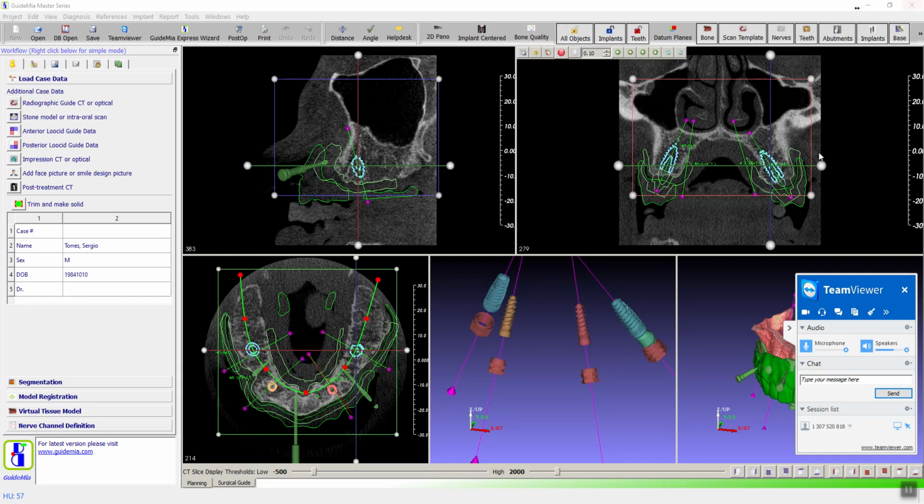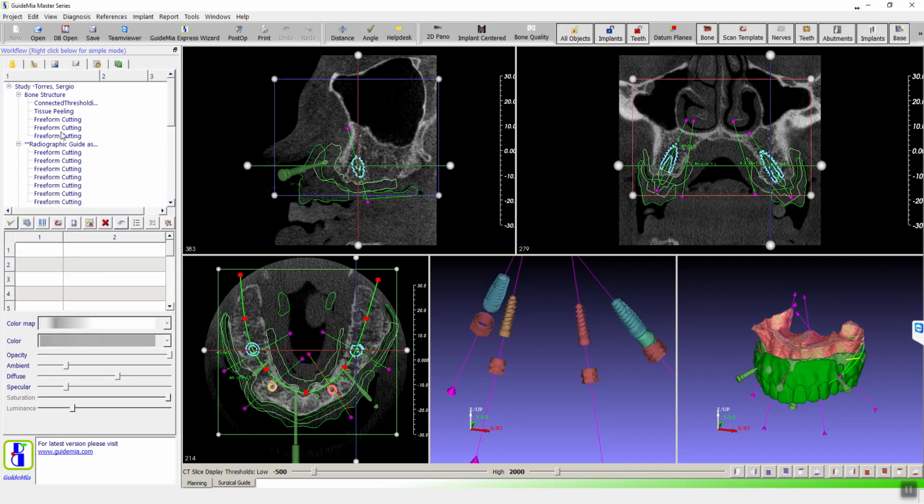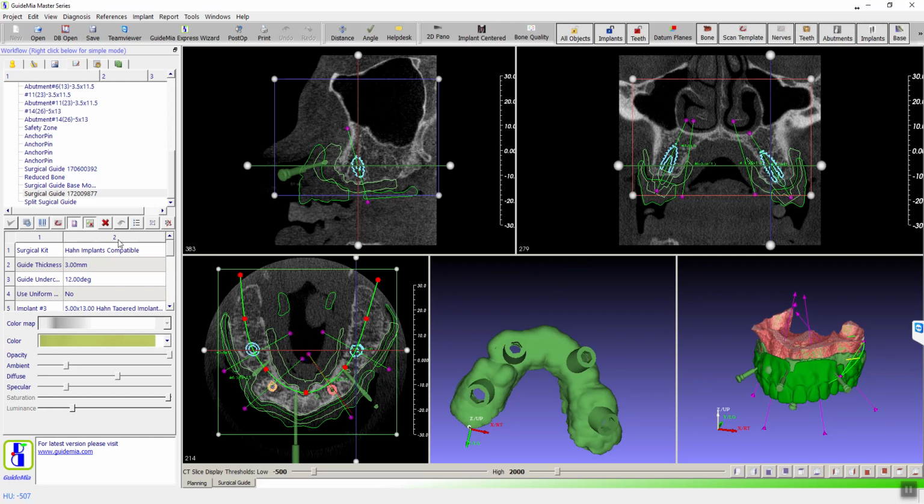Right. What I don't want the doctors doing is trying to import CT scans and plan and call us and expect us to give software support. Right, because we minimize the functions they have. They only just place implants, adjust the implants. All right, I'll want to play with that just to be sure. That's all I want to give them.